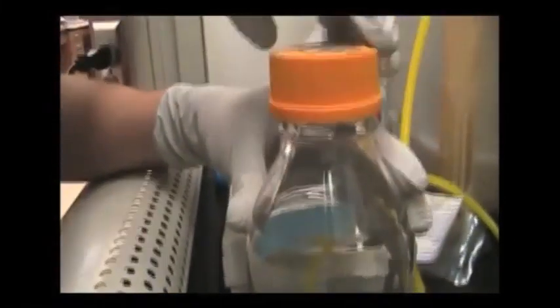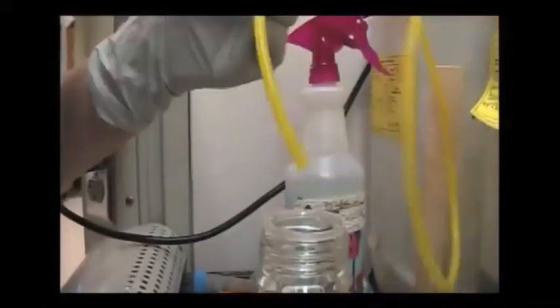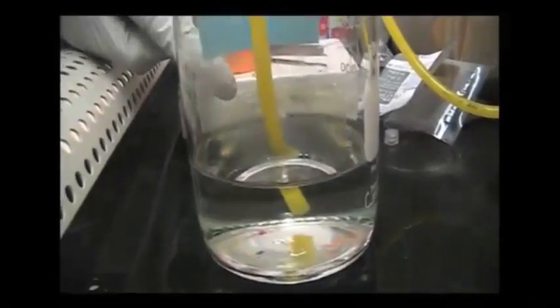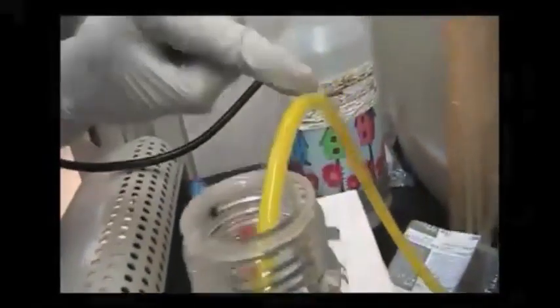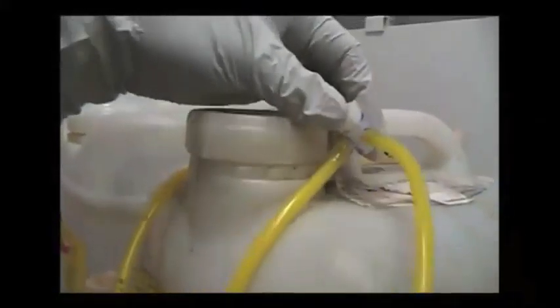The first thing you'll do is unscrew the cap, and there's a hose that leads from the solution to this perfusion machine that we're going to use. The solution will go all the way down this tube, up and around until it gets to a valve. Right now, this valve is set on a red light pretty much. It's a stop sign. Until I twist it over to the right, no solution will be able to get to the machine. So twisting it to the right pretty much acts as a green light and the solution is ready to go to the machine.